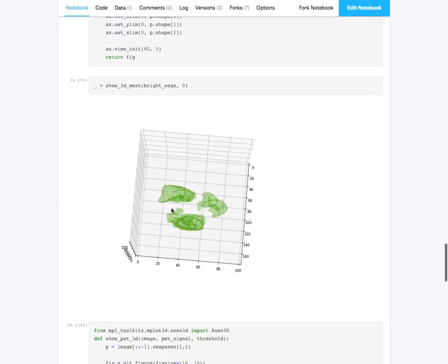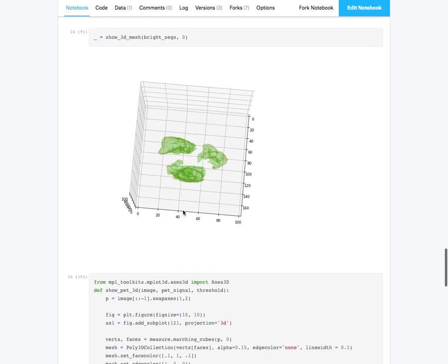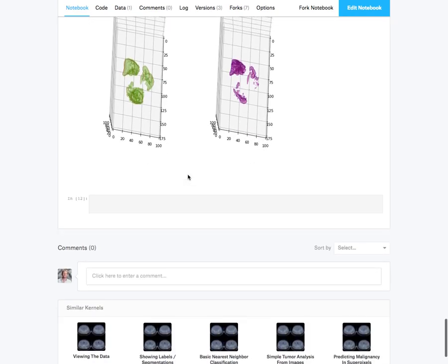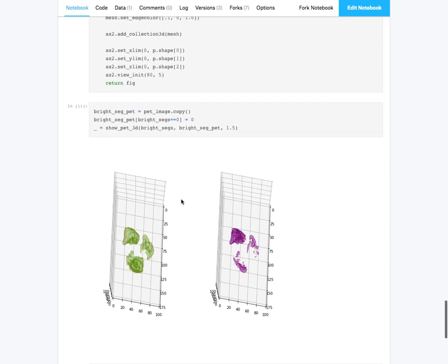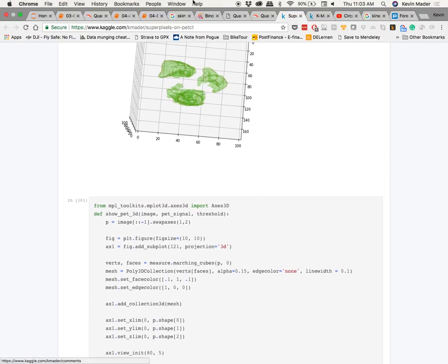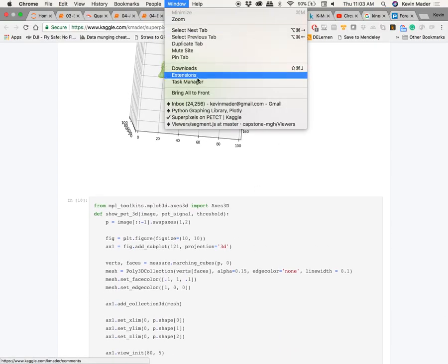And so here you perform segmentation of these organs in a fairly reliable way. I mean, this looks quite a bit like a liver to me, and doing that with a single threshold would be much harder. And yeah, you can also weight it by the values inside it, but that's less important.